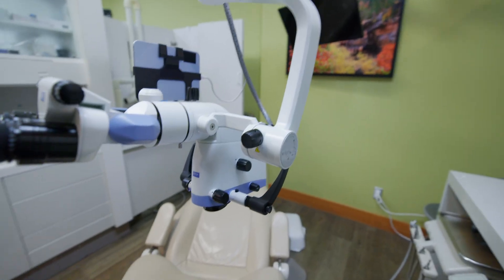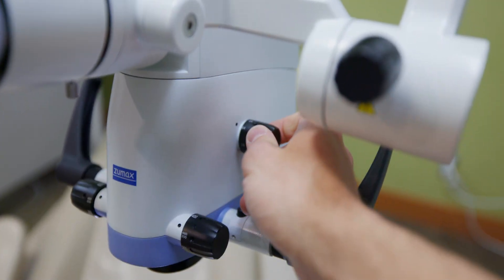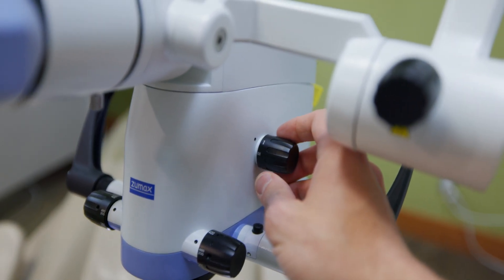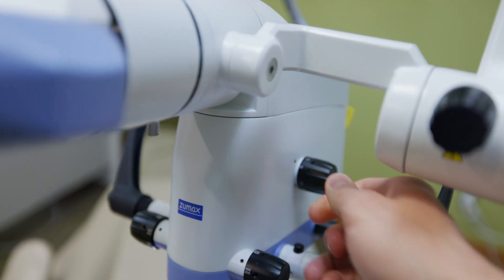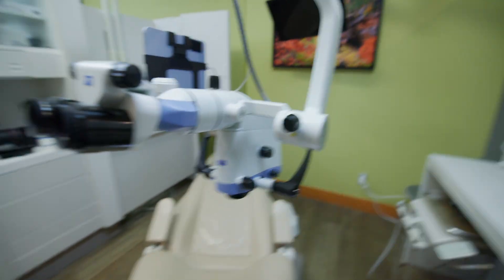One thing I've noticed is a little bit odd — the magnification knob is opposite that of the 2380. So zooming in and zooming out is opposite of a different scope from the same company. For most people, you're not going to have different scopes from the same company, so it would be a non-issue. But for me, I have to remember which way to turn it to zoom in versus zoom out. It's a minor thing, but it is one thing I noticed.